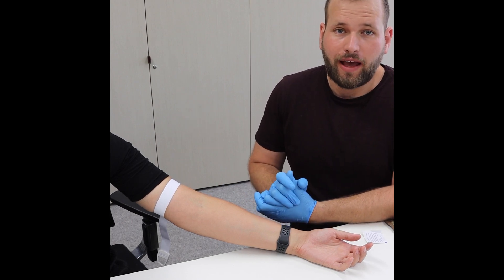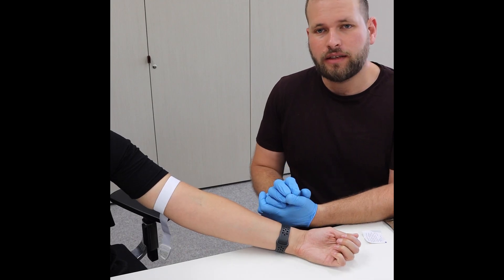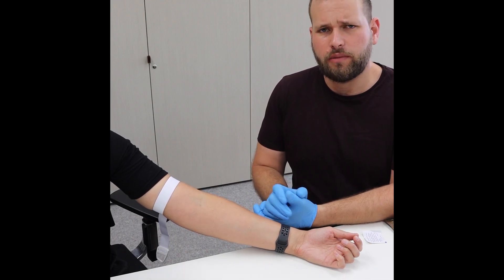Hey everybody, I'm Ben from Real Response and what I'm going to be showing you today is a little trick on how to advance a cannula when you think you may have hit a valve.